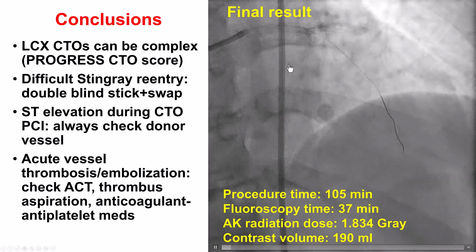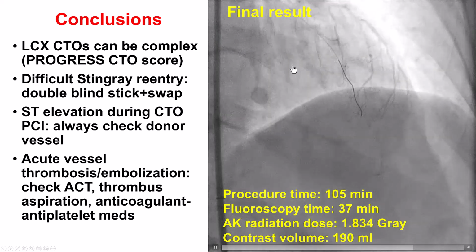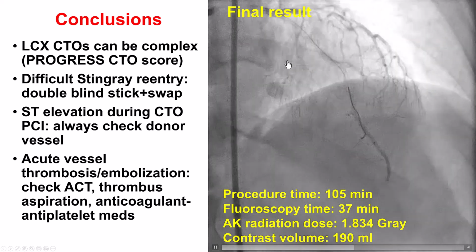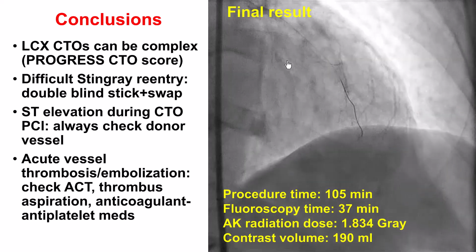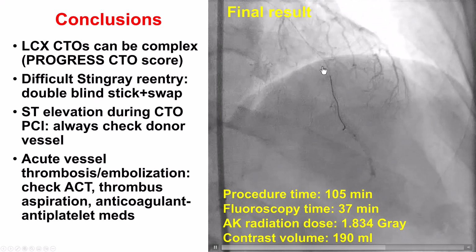We did not have any stents there. Nevertheless, the patient developed acute occlusion, partial occlusion. And this is unclear as to why it happened, but it is quite possible that there was some thrombus in the guide that embolized to the mid-LAD.